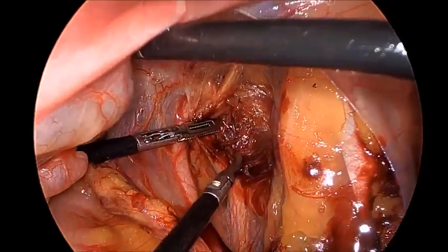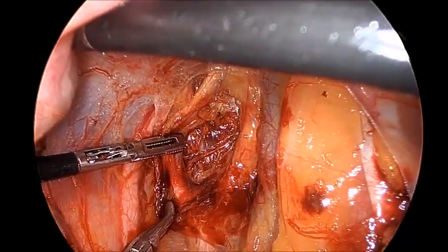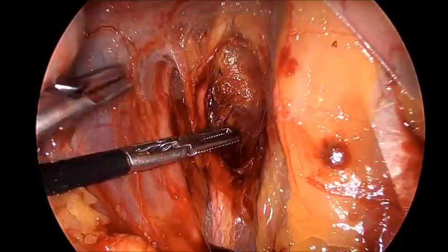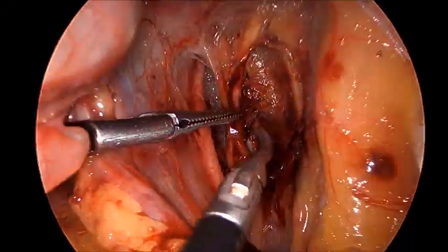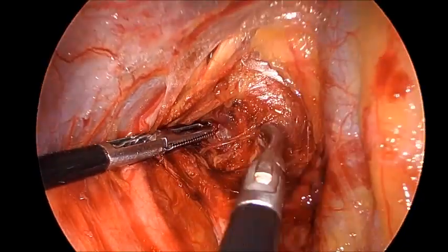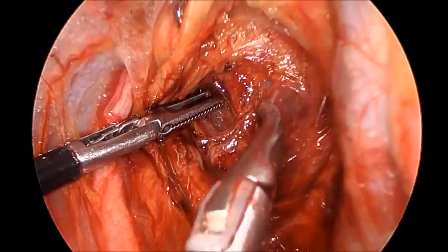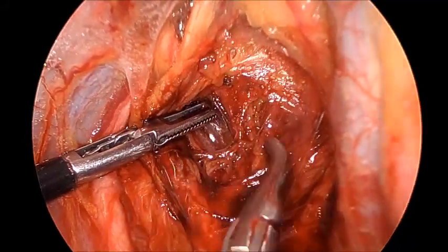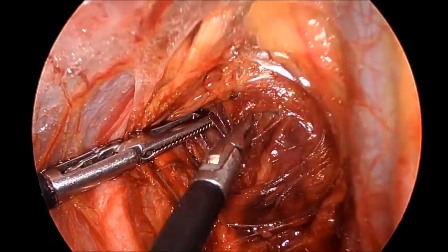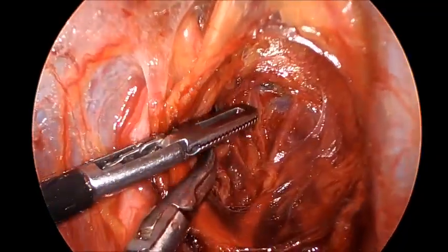What we are doing is we are trying to identify the space below the level of this uterine artery. We can see the obturator now at the base. During pelvic lymph node dissection, approaching this space is very important because we have to remove the lymph nodes from this space.